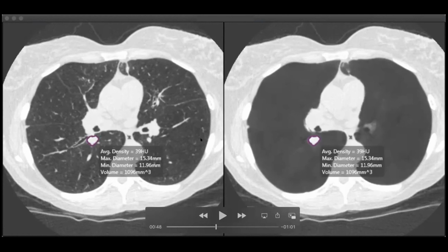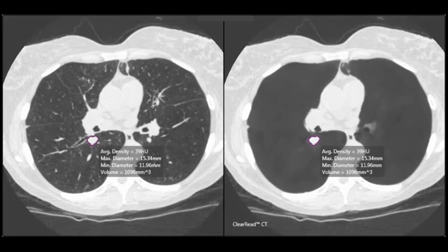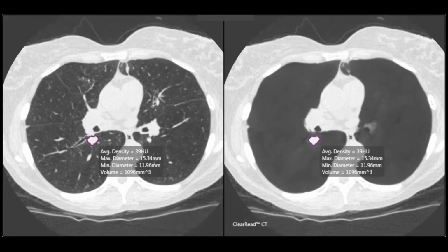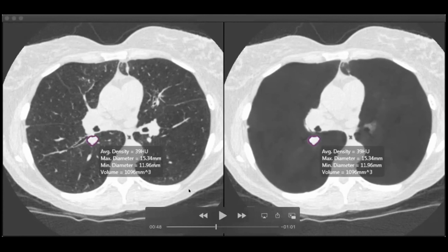And so again, as radiologists, if you want to pull out the calipers and measure nodules all day, by all means go ahead. Just recognize that we are inconsistent and there's going to be inter-observer variability. But having an algorithm that has been trained on tens of thousands of cases to be able to do this precisely and accurately, and it's repeatable with precision, is a very valuable tool. And it's one less thing that I have to do as part of my imaging interpretation.